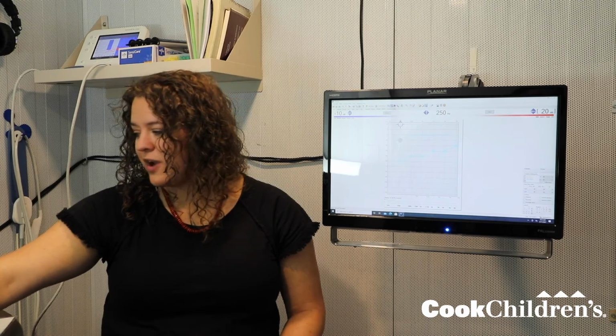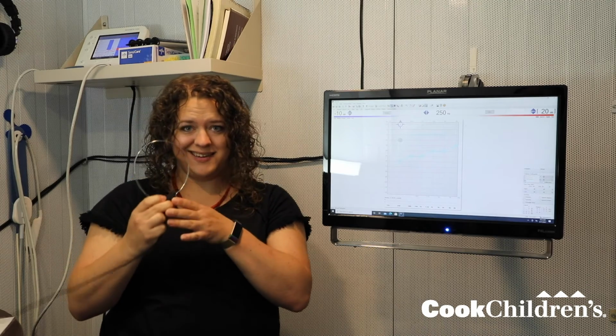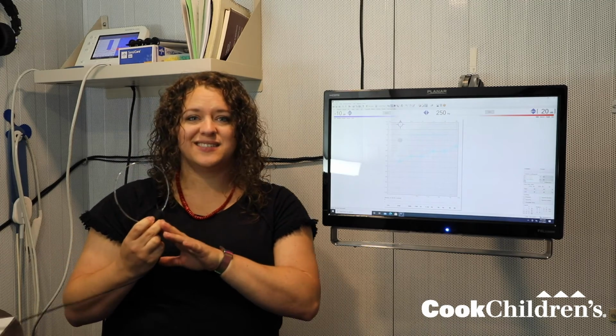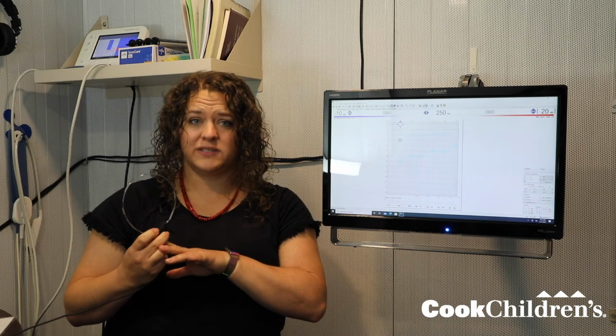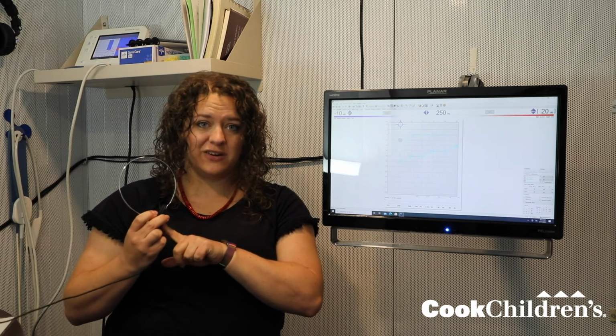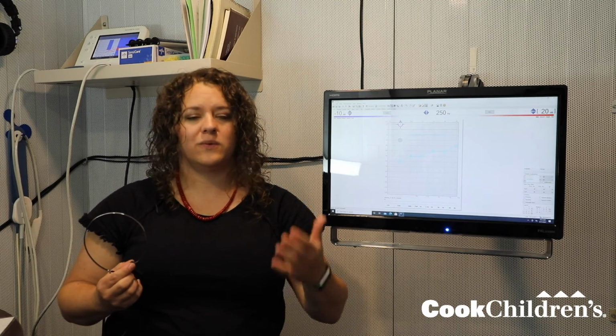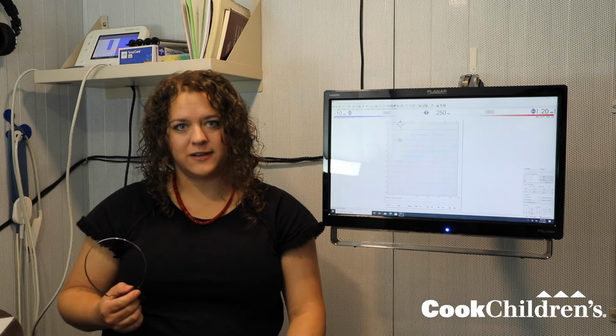What's happening with those brackets is we probably put this headband on your child's head, and it lets us test just how their hearing nerve is working. So if they heard normally with their hearing nerve, but with headphones on, we had to make sounds a little louder, we know that they have a conductive hearing loss.